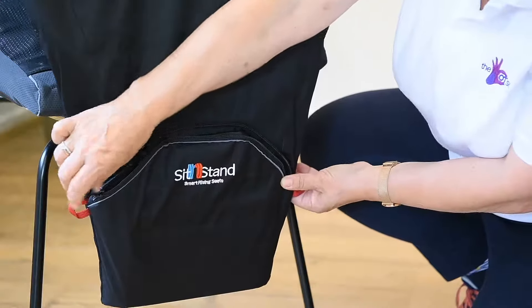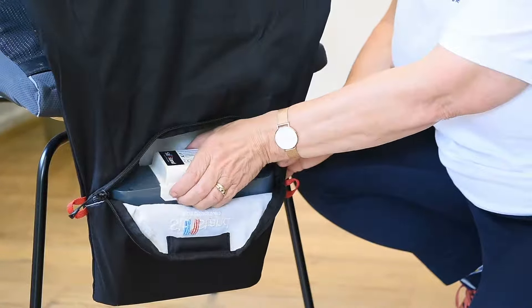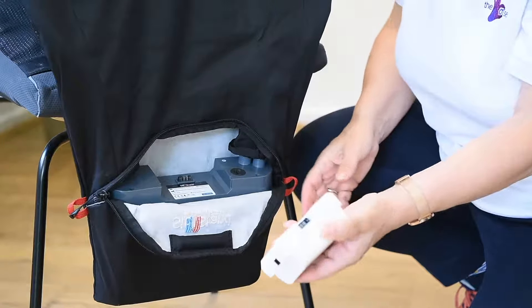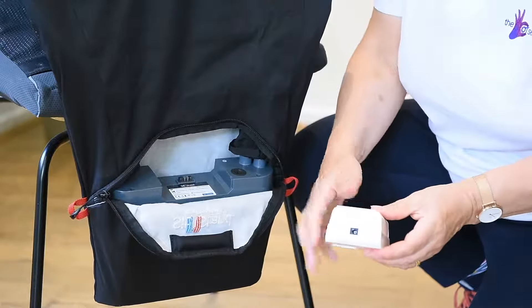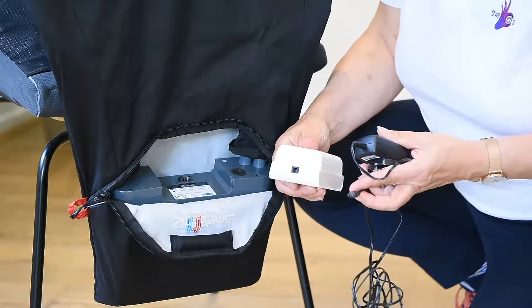The battery is contained in a zipped pocket in the back of the product. It's easy to remove and slides out effortlessly, charged using a simple plug-in system similar to a mobile phone.